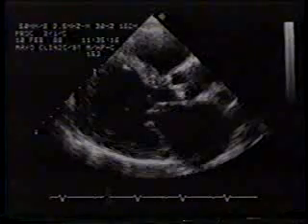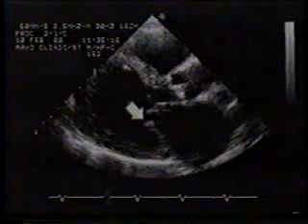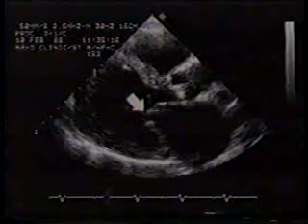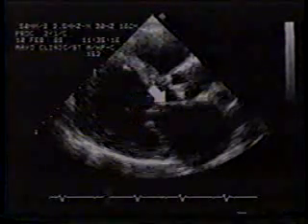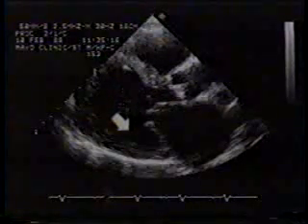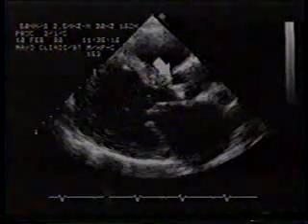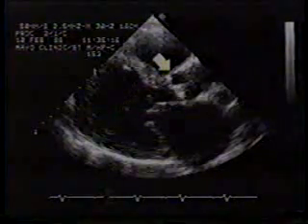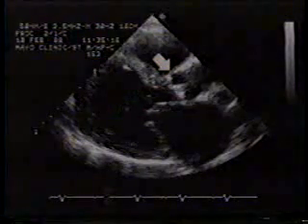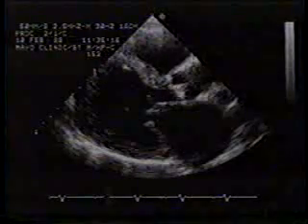This patient has rheumatic mitral and aortic valve disease. The mitral leaflets are slightly thickened, and the anterior leaflet opens with a hockey stick configuration. The left ventricle is slightly enlarged. There is dense calcification of the aortic valve. In real time, you will see that the aortic valve has greatly reduced mobility, and there is severe reduction in left ventricular systolic function.